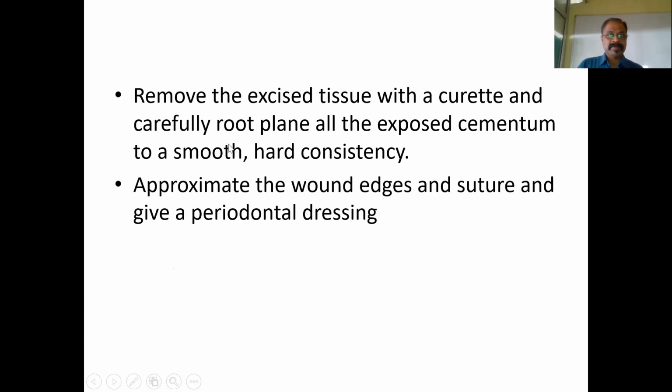Now, once you excise this with the internal bevel, you take a curette and thoroughly root plane the area. You also make sure that the exposed cementum with the irritants, or what we call the necrotic cementum, is totally removed, and a root surface which is smooth and hard in consistency is achieved.